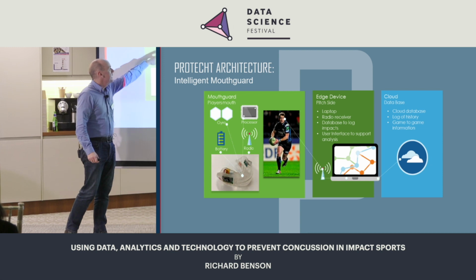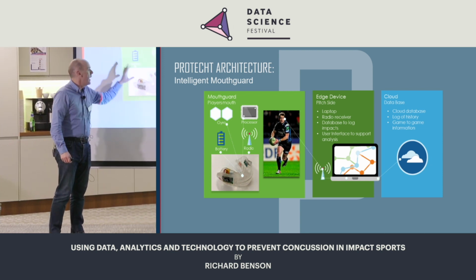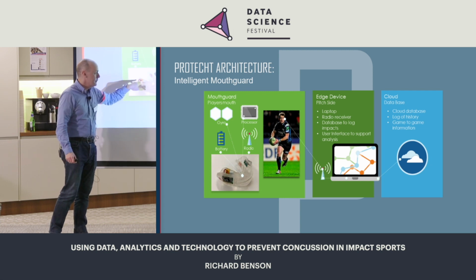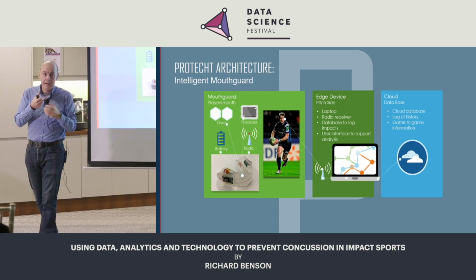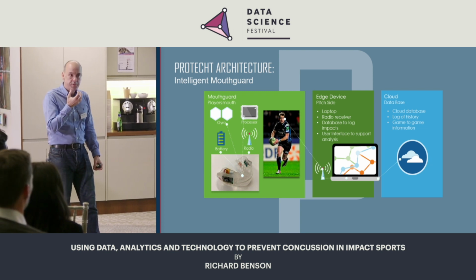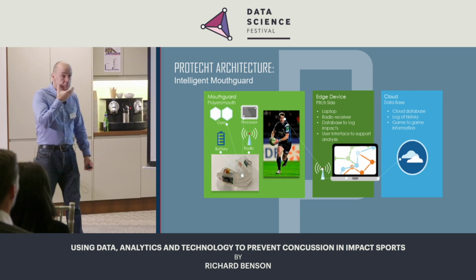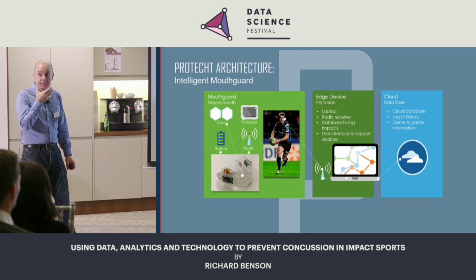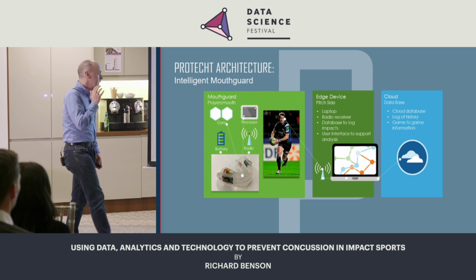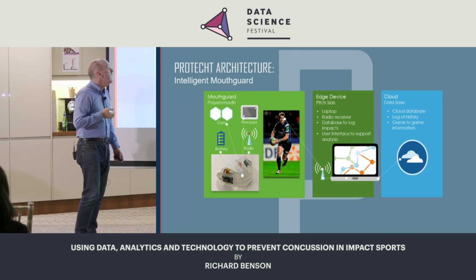So inside that mouthguard, there's a gyro, there's a processor, there's a radio unit. All of this is being put inside that mouthguard, and these are all specially formulated. Each one is specifically measured for a rugby player, and the rugby player gets it molded exactly to their mouth. So there's a really tight coupling to their teeth. So as accelerations are being recorded, we're really confident it's not just the mouthguard rattling around.